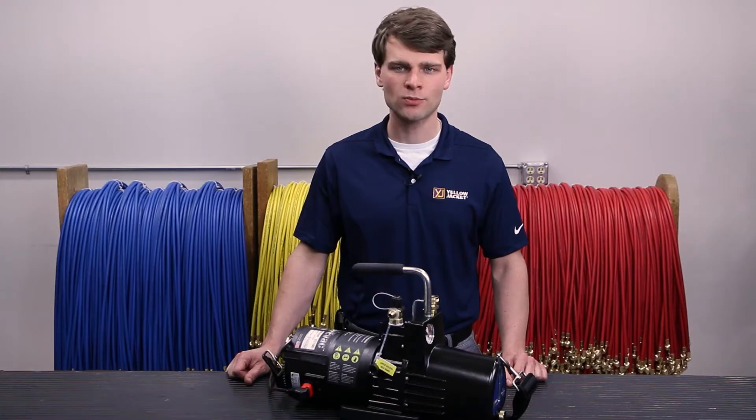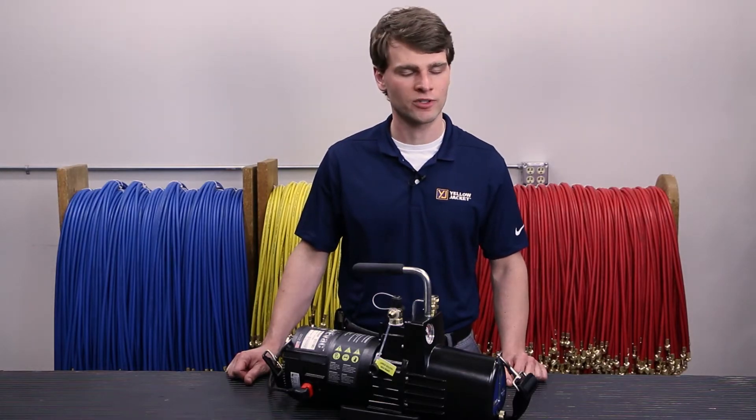Today we're going to go over some best practices when using your SuperEvac Plus II, and some common mistakes and what they look like.